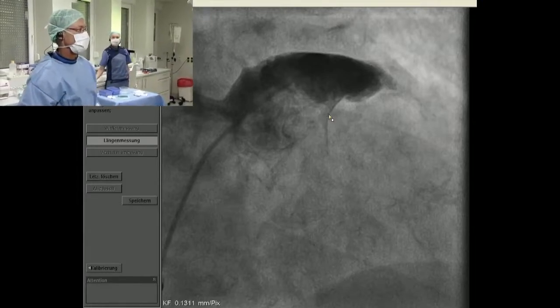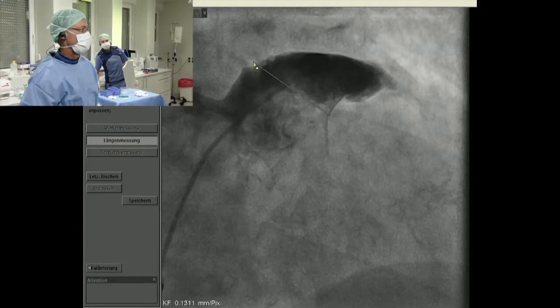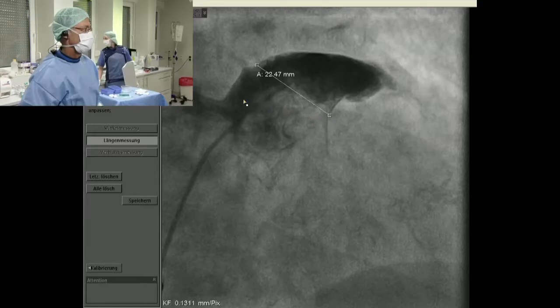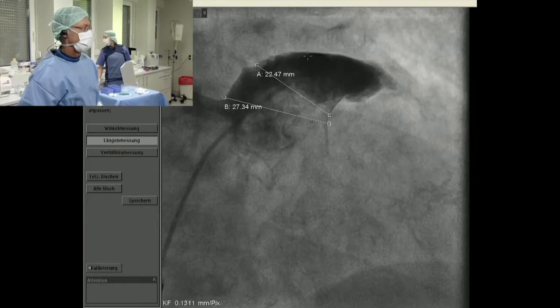I think the Watchman might be a little more difficult. Because of the depth, more like. Yeah, so these are the ones, the so-called broccoli types, that we do. The sheath should not necessarily be hugging the Coumadin ridge. If you leave the sheath a little bit diagonal, you gain some more space, and the device cants by itself. So this is one where the classical sheath positioning does not have to be followed.